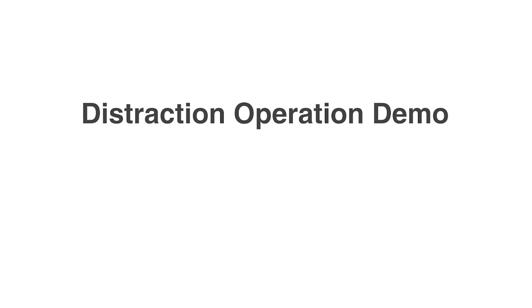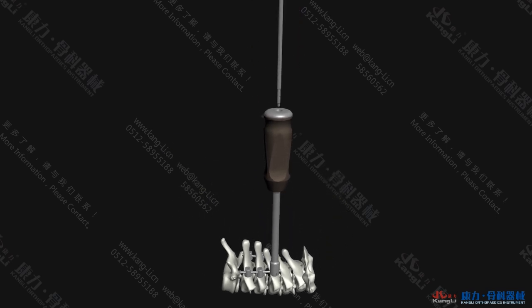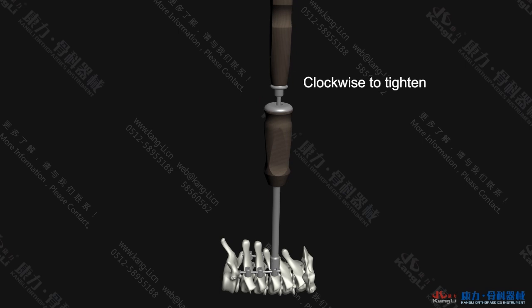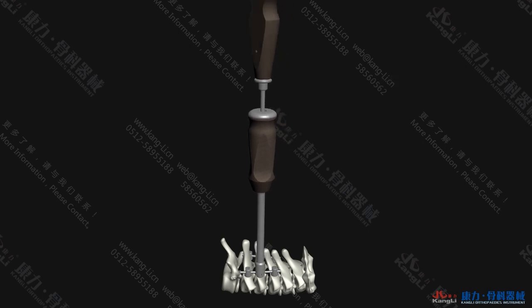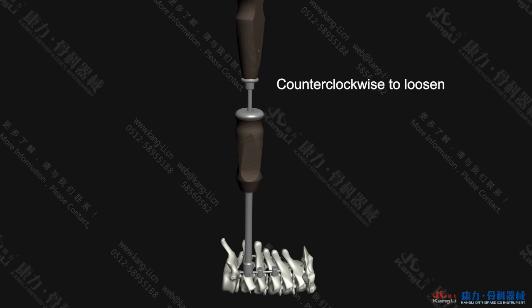Distraction operation demo. Place the anti-rotation sleeve. Insert the T2.9 quick coupling wrench into the central hole of the anti-rotation sleeve. Tighten the set screw on one end, leaving the set screw on the opposite end loose.